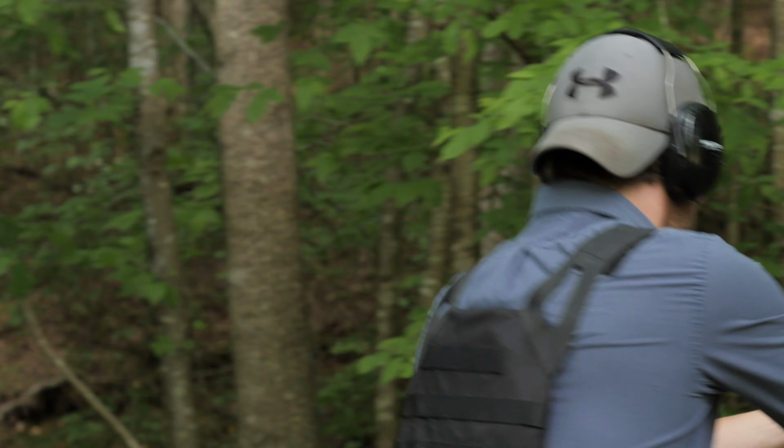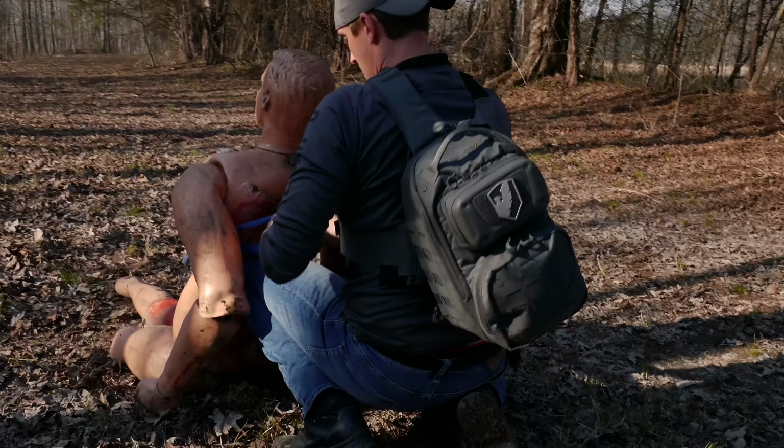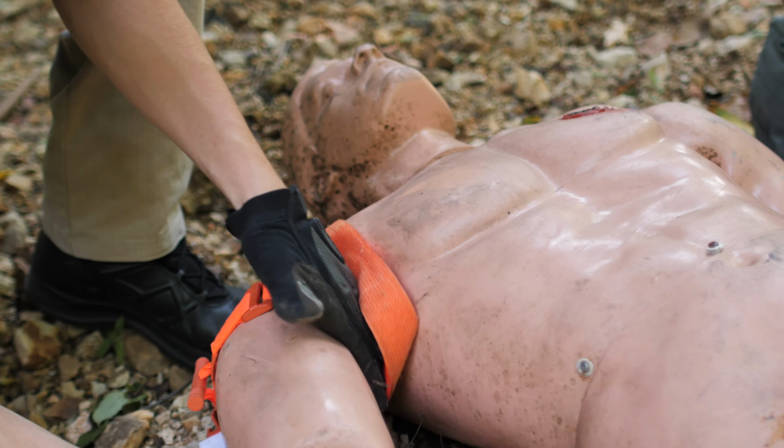What are we assessing with these tourniquets? Well, you gotta remember, these are protocols that are used for stressful times, stressful environments most of the time. So we're throwing a tourniquet on, there may be bullets flying overhead, this may be an active shooter case, this may be a mass casualty where we're triaging and trying to figure out who to treat first. So we have to go back and make sure that what was done in haste in the first part was actually doing what we think it's doing. So we're gonna reassess that tourniquet and make sure it is stopping blood flow like we want it to.